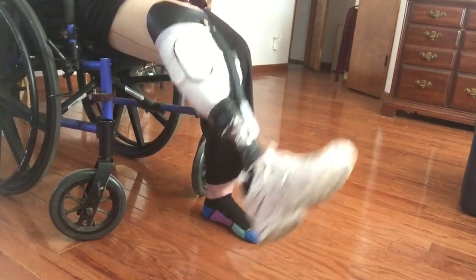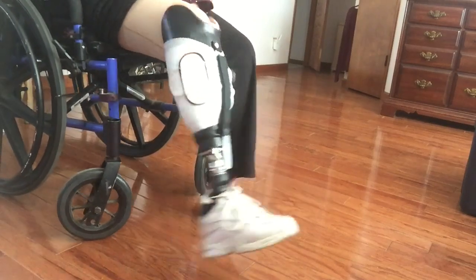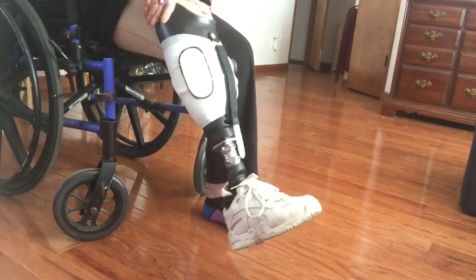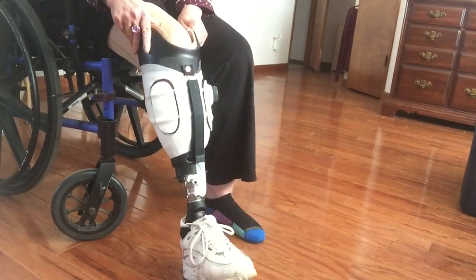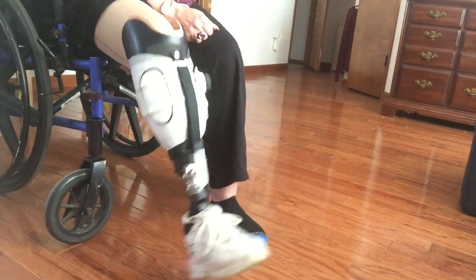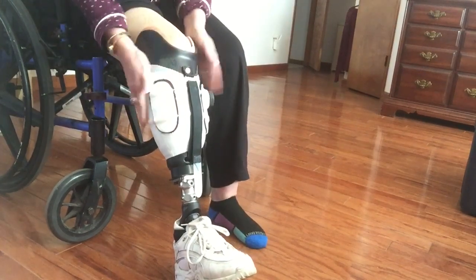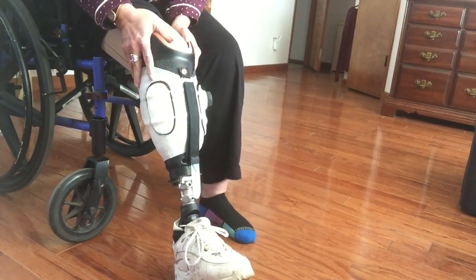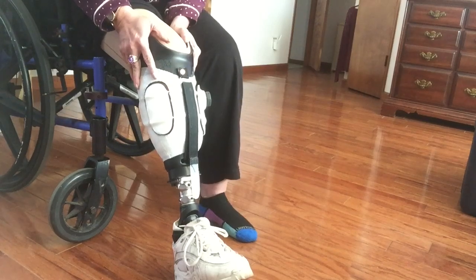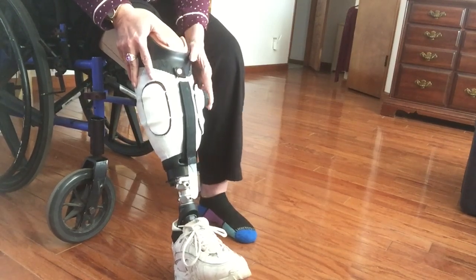I feel very secure in this — my leg's not coming out and it's not going to turn on me, that part feels really safe. I don't think it's very attractive though. I was really hoping for a lower profile so I could start wearing normal pants, but that may be something I just have to come to terms with.